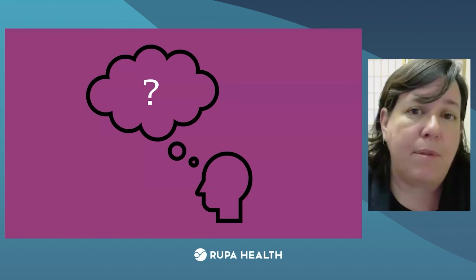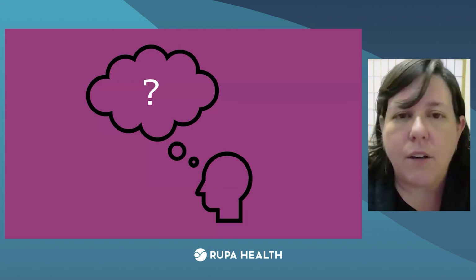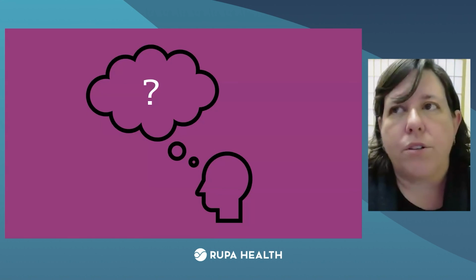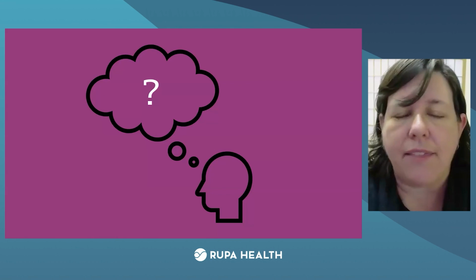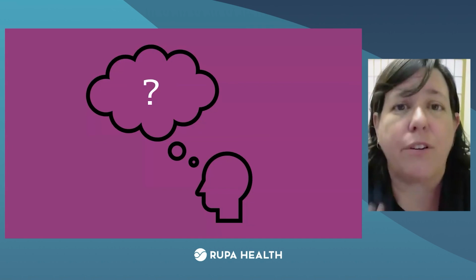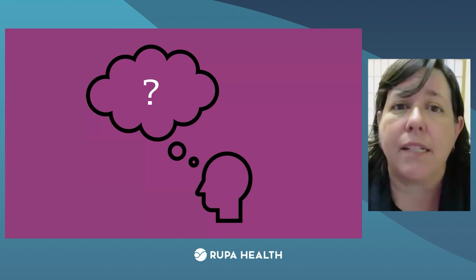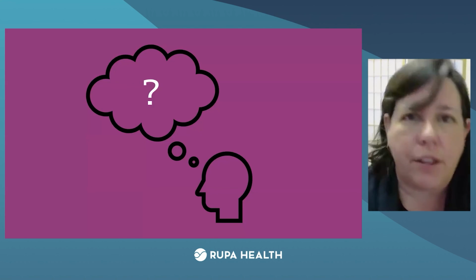Now, I've seen those labs be really high. I've seen them at 1,000. I've seen them higher than the lab can measure. And I know there's always a story about someone who gets put on a magical supplement or stops eating gluten and their levels just drop to nothing. And I love those stories. I've had them too. But I want to also give you permission that my patients have also not done that and have had high antibodies for a gazillion years, even though we're doing everything else.